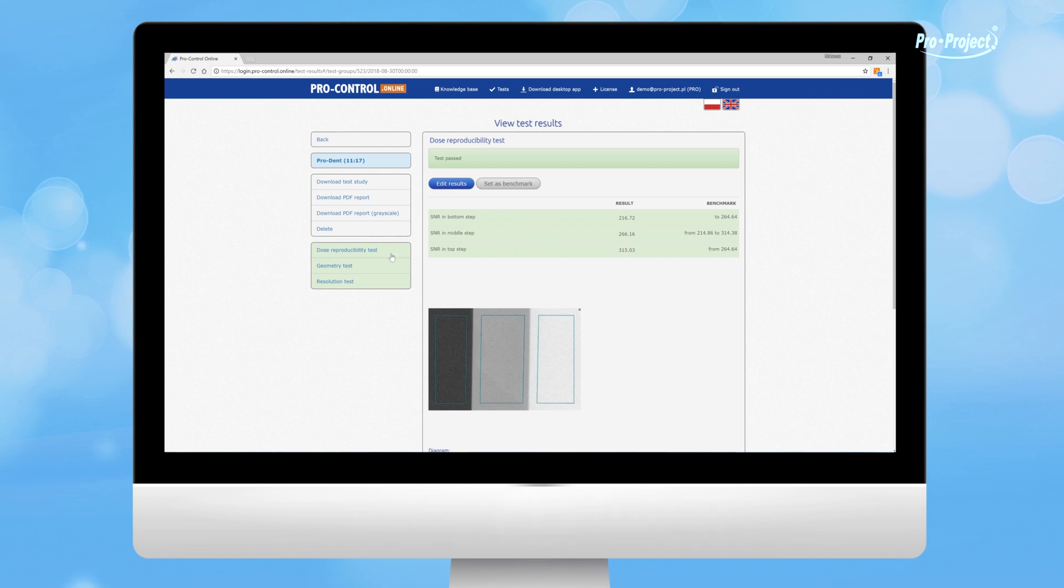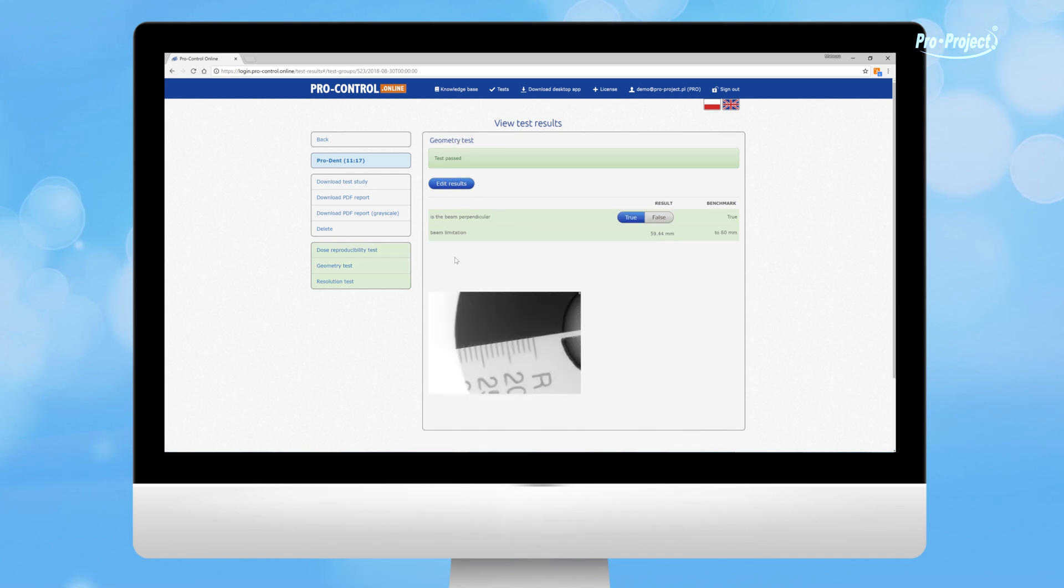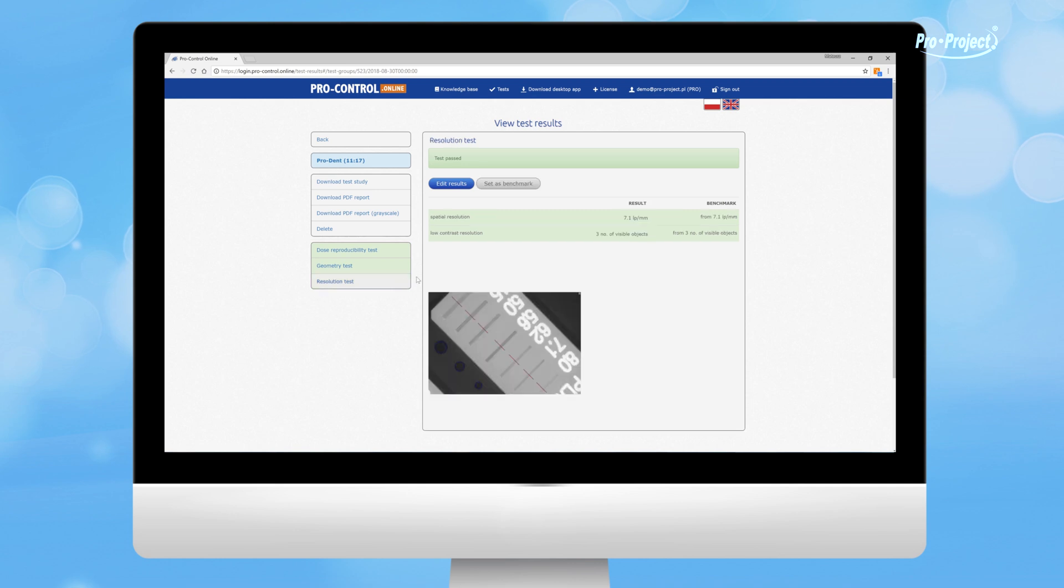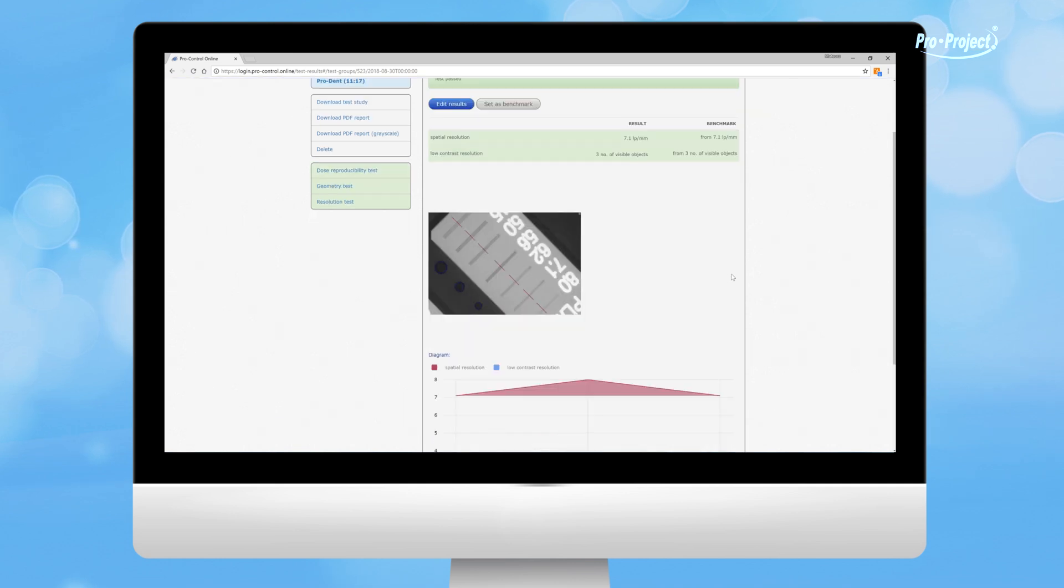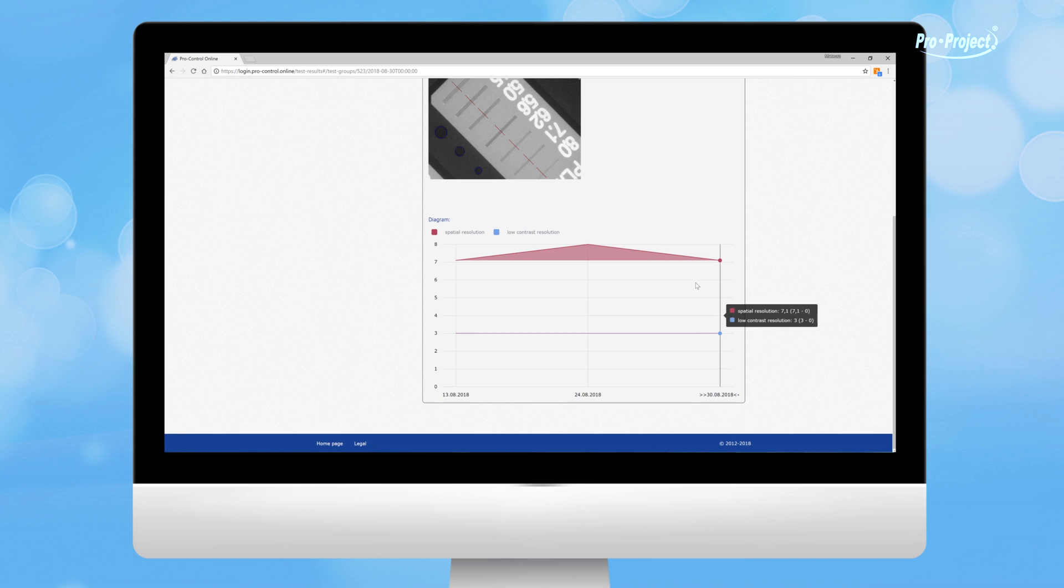All tests performed are listed on the left. If the result of the analysis is positive, it will be marked in green. If not, it will be in red.